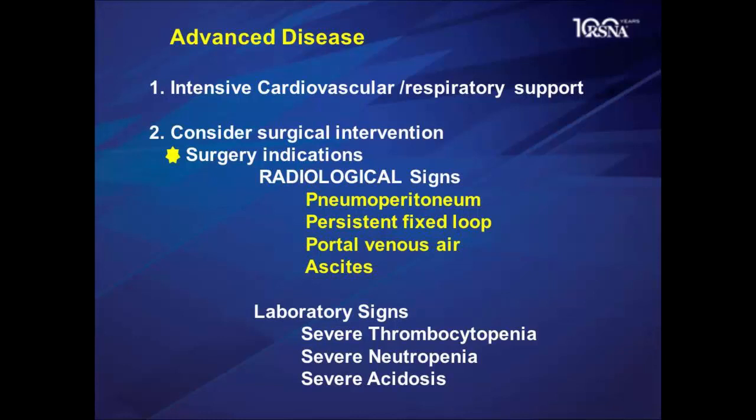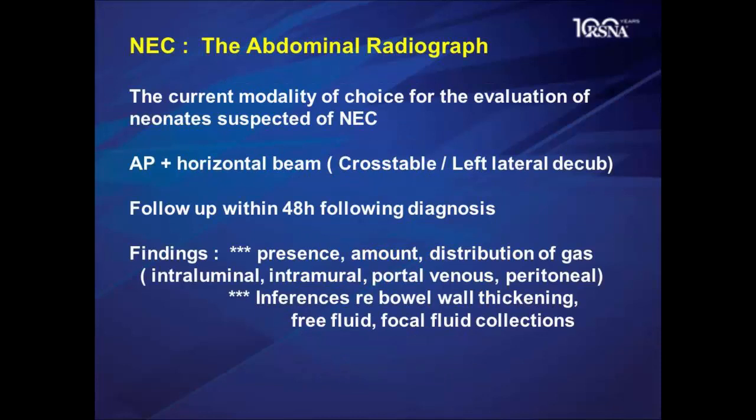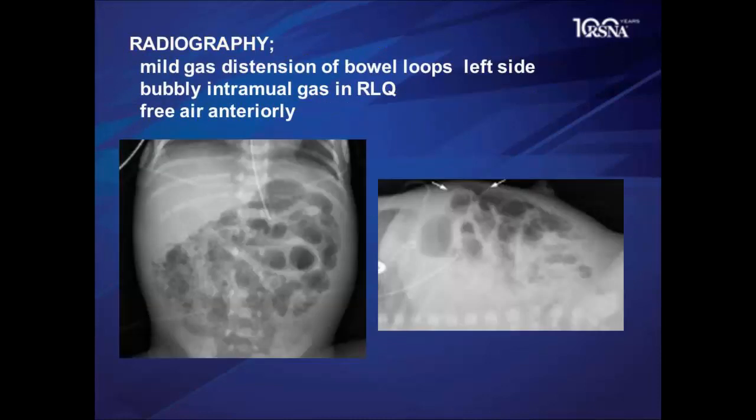So the abdominal radiograph, don't hesitate, we get 2 views at least for the beginning, and then the concern about radiation exposure comes, and then one elects probably to have 1 view each time, either supine and then cross table, to try to define free air versus status of the bowel loops. Now we look at the gas distribution and also the wall thickening or the apparent loop separations, and from ultrasound we have to look for fluid presence or not.